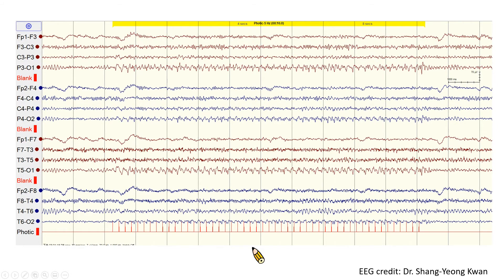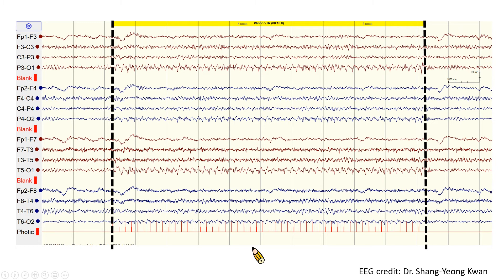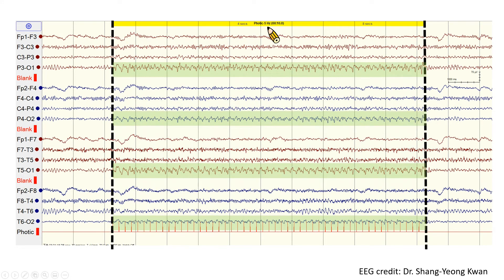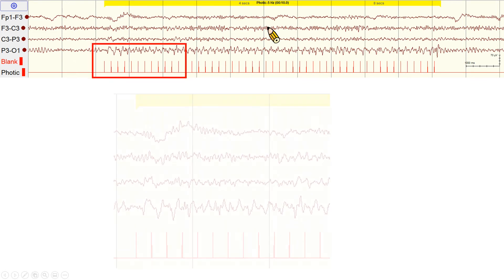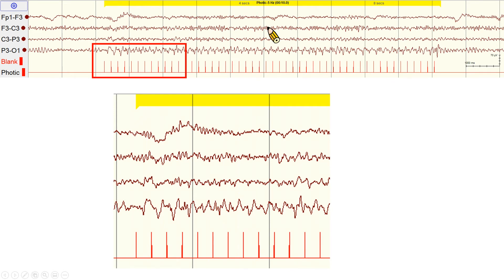This is a double banana montage EEG. Between the dashed lines are periods of flash stimulus trial with a frequency of 5 Hz. We can see beautiful photic driving responses in the occipital regions. By magnifying the picture, we can see the characteristic time lag of 100 ms between the photic stimulus and a discharge. A harmonic driving response with 5 and 10 Hz under IPS of 5 Hz is also identified.